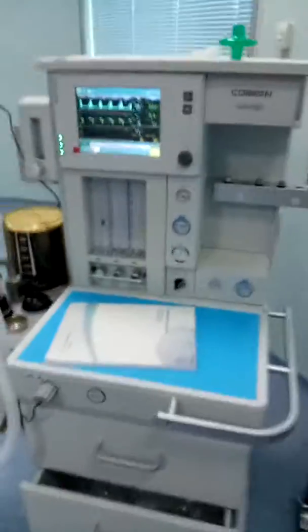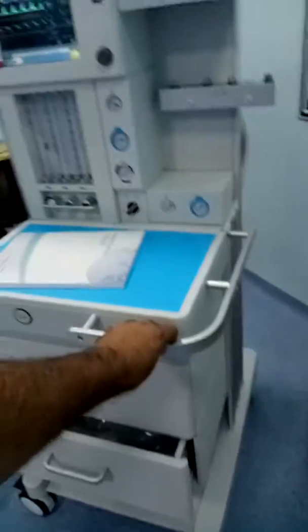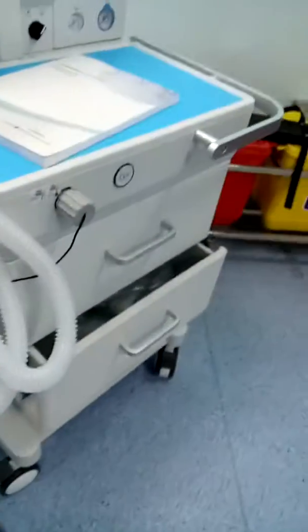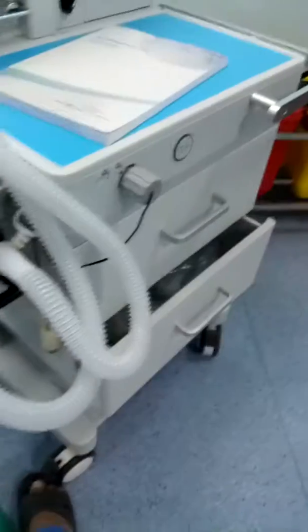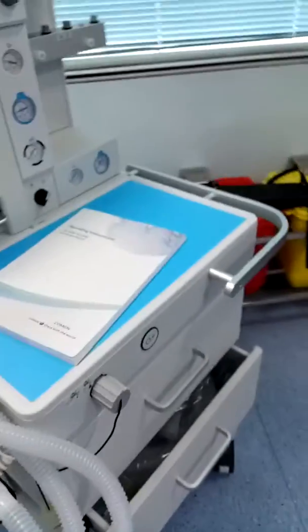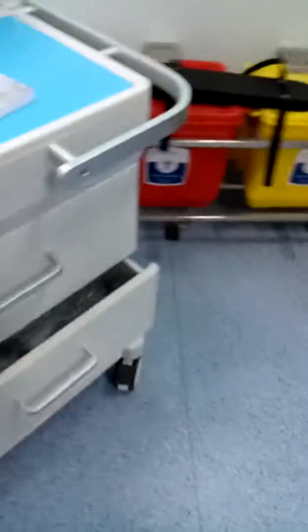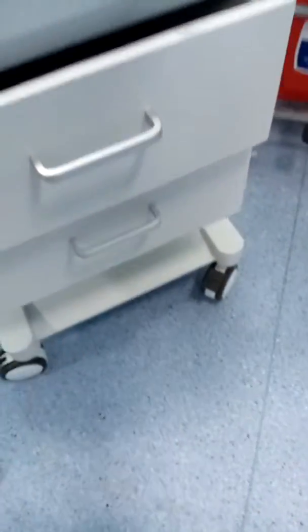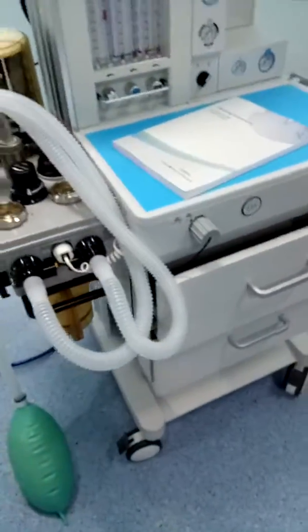This arm is used to carry and move the machine around the operation theater. This is the locking mechanism, and these are the caster locks — caster locking. You can see there are two deep drawers, plus one more. You can put extra circuits and other supplies in here. You can also see the alarm from here.